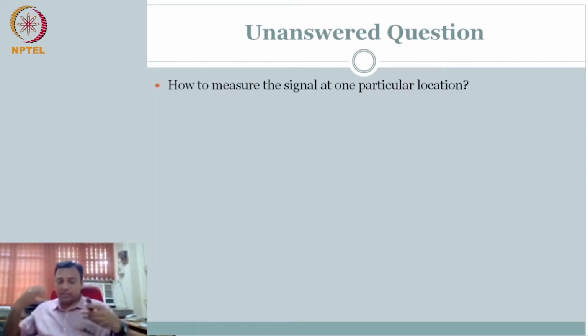Because if you want to do this as imaging, we need to measure at each location. Therefore, we should be able to tell, this is the proton density here, that density there, and therefore you get an image. How do we do that? Before we go into the details, think about the first principles of what we covered. In nuclear magnetic resonance, NMR, the nuclear spin is the important guide.